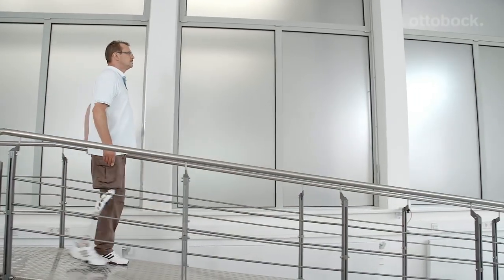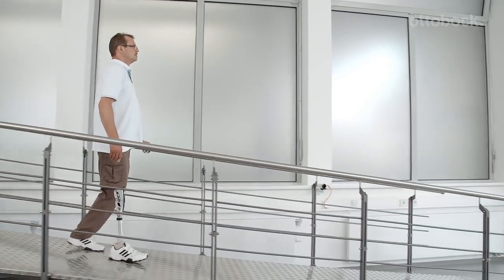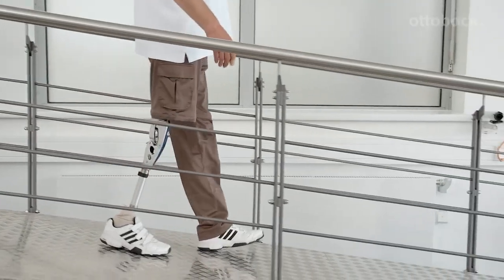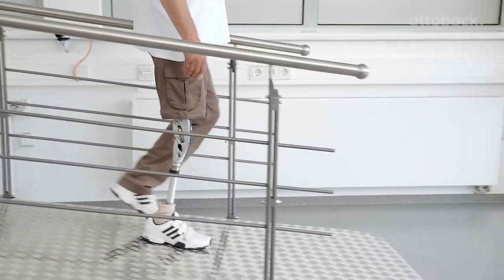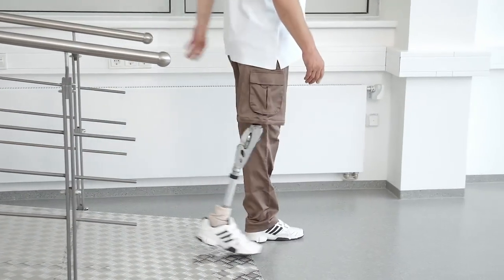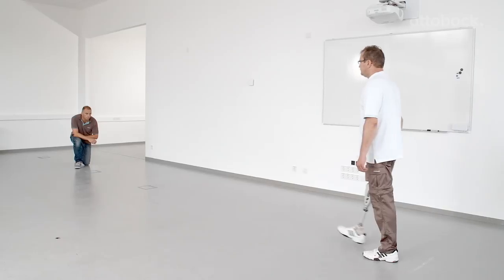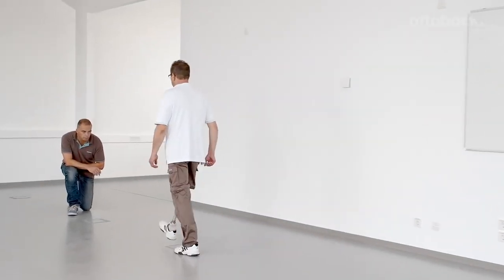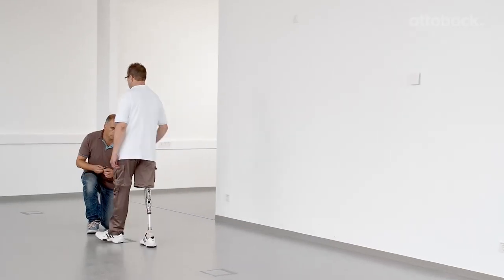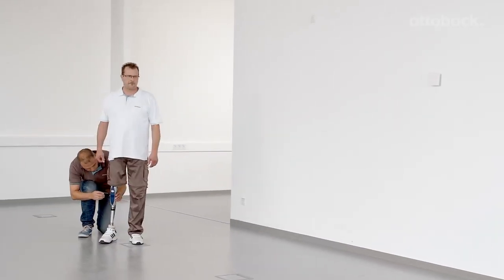Descending shallow slopes is possible with the 3R60 due to the 15 degrees stance phase flexion. In general, the steeper the ramp, the smaller the steps the user has to make. At this point, it is now time to fine-tune the settings. Here the extension damping is tightened a little more, so that the extension stop is softer.